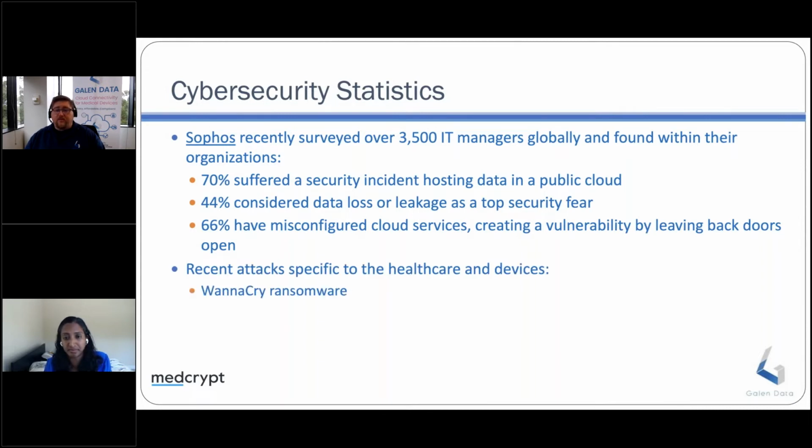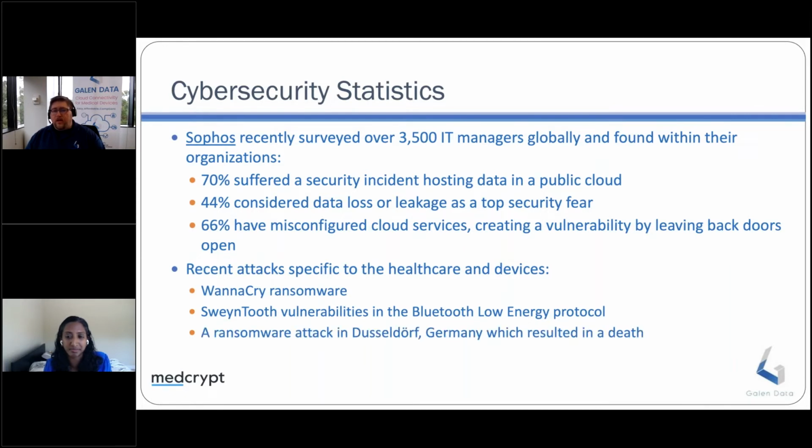A recent attack specific to the healthcare and devices, the WannaCry ransomware that was about 1.5 years ago, the Sweyntooth vulnerabilities, which was a little bit longer ago, but that affected a lot of different companies. A previous one that I worked for that Dwayne mentioned, Ortho Excel, the FDA was on us quite heavily about that. And then a ransomware attack in Dusseldorf, Germany, which actually resulted in a patient death.